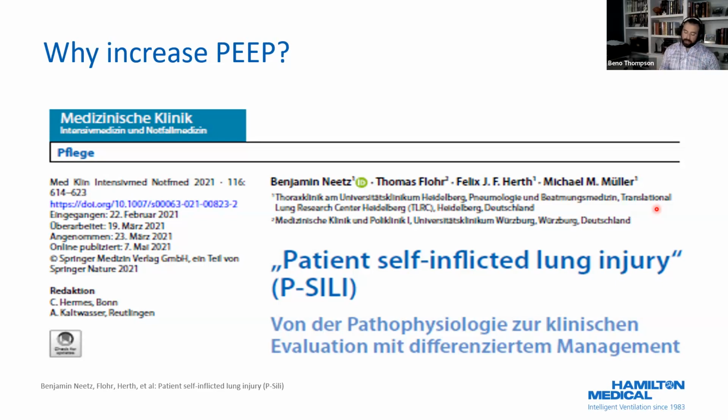And I want you to think outside of reverse triggering, but everybody's had those patients where they're heaving and hoeing, chugging, and you're going up on the pressure support, you're going up on the pressure control, you're going up on the tidal volume, but you just can't capture them. Well, it's probably because they needed more PEEP.